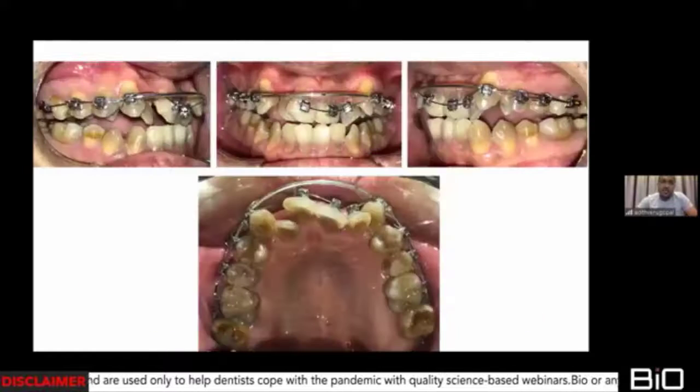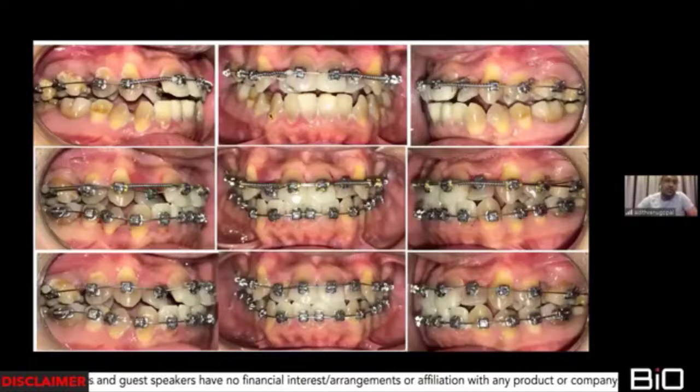And there was a stage where I was just proclining the teeth. I even went into 2-arch wires in order to procline or to alleviate the crowding. As you can see, I've used a heavy overlay, and then I've used an 012 thermal niti to give those light forces. I tried everything, but it didn't happen. And finally, I had to resort to extractions.